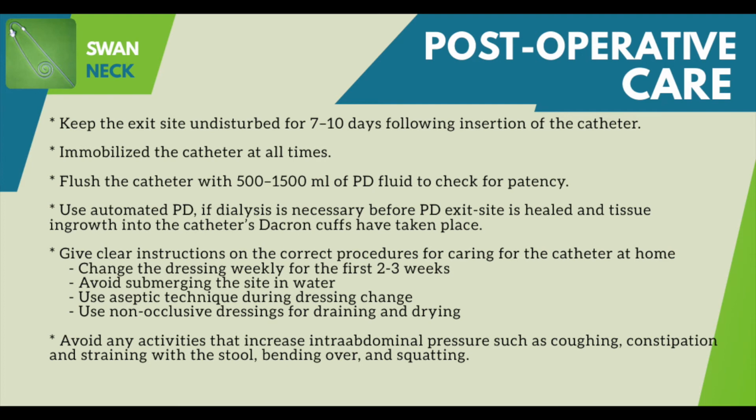Ideally, PD should not be started until healing of the exit site and tissue ingrowth into the catheter's Dacron cuffs have taken place, usually after 10 days. If dialysis is necessary before this time, automated PD would be the preferred method to minimize the risk of leakage of PD fluid by allowing the patient to be treated using small fill volumes of fluid in a supine position.